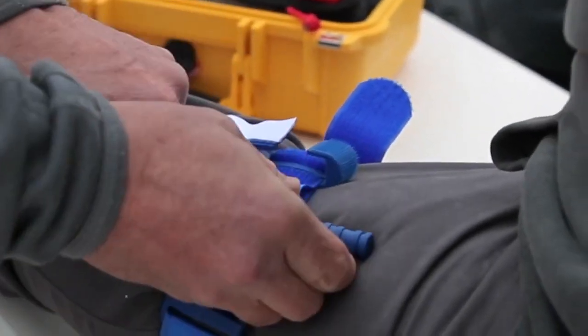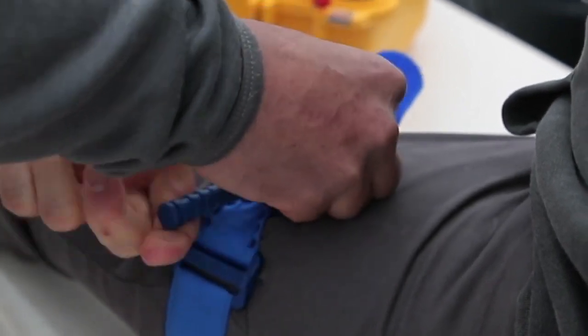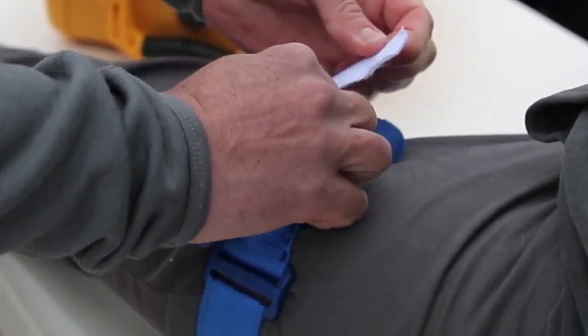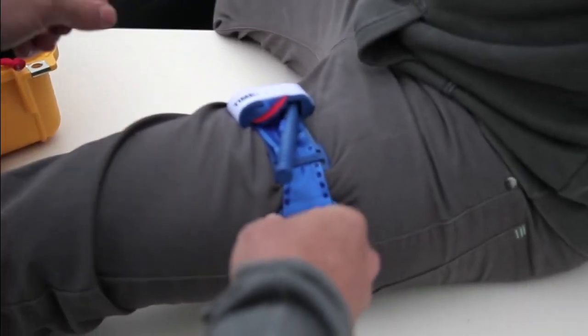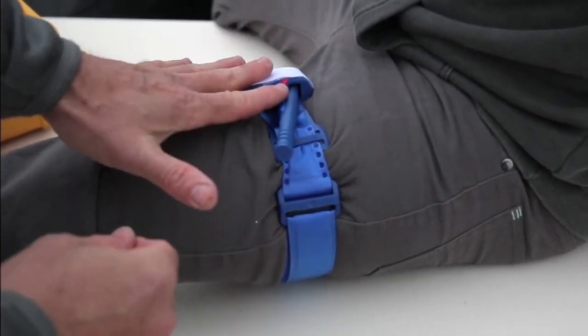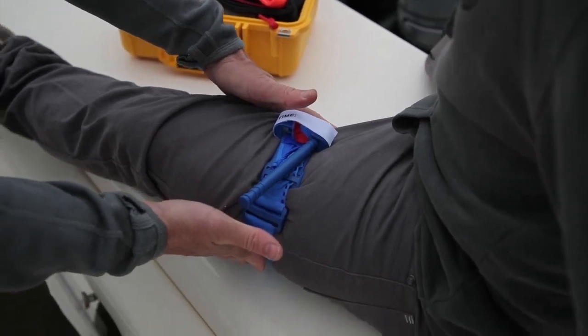Just like your arm application, give it a twist until the bright red bleeding stops. Engage the windlass in the clip and pull your time strap across. The kit comes with a marker so you can write the time that the tourniquet was applied, so that first responders know when it was applied. And you've bought yourself time to get to help.